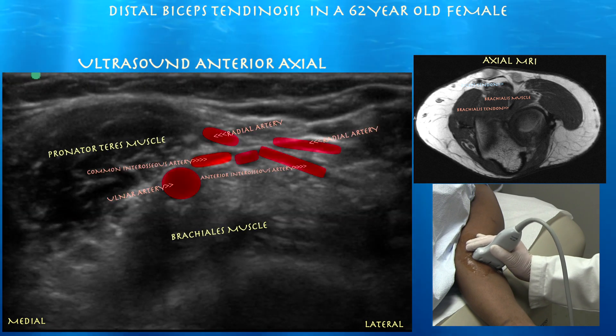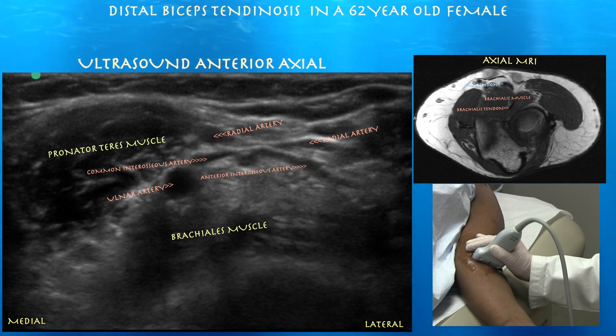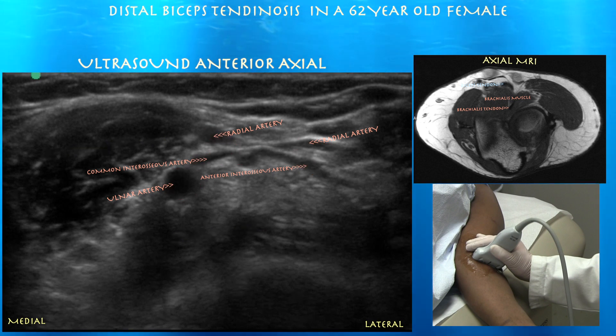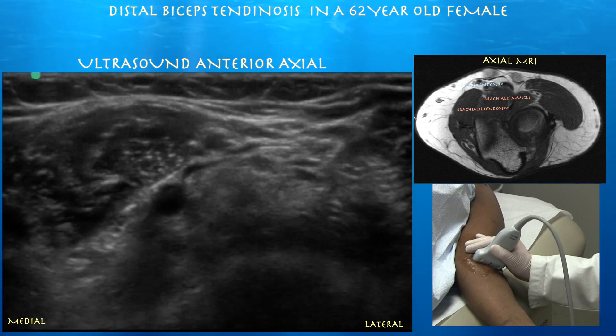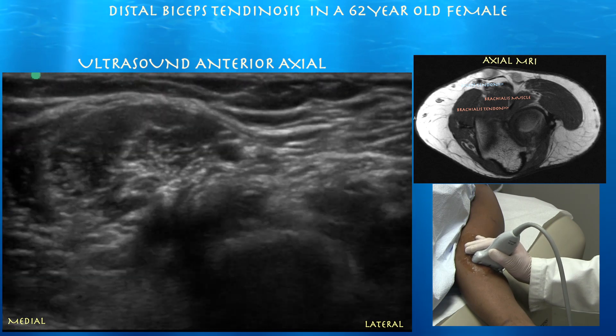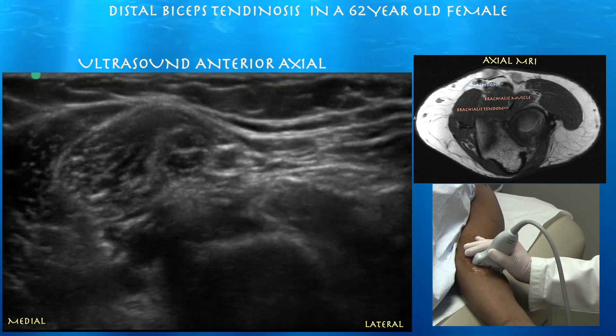The ulnar artery is beginning to give off the common interosseous artery, which then feeds into the anterior interosseous artery. The radial artery is superficial to that and courses laterally, kind of parallel to the common interosseous artery, which subsequently divides into the posterior and anterior interosseous arteries.